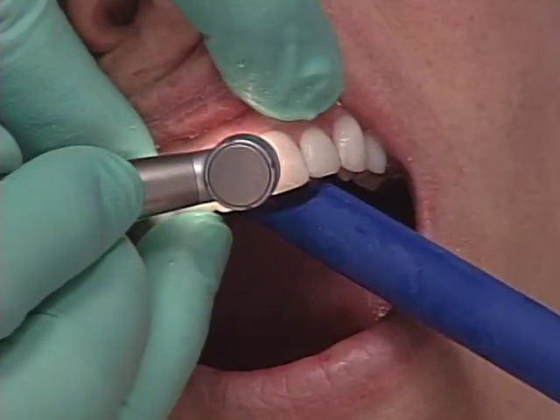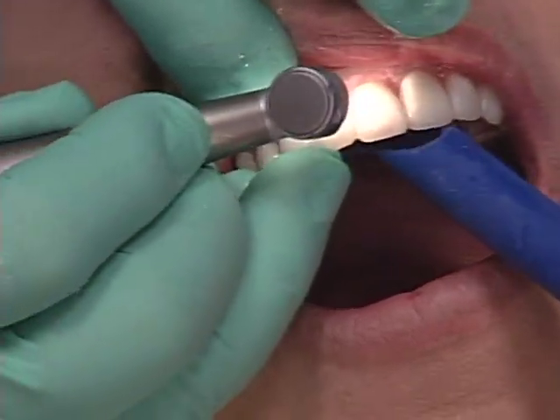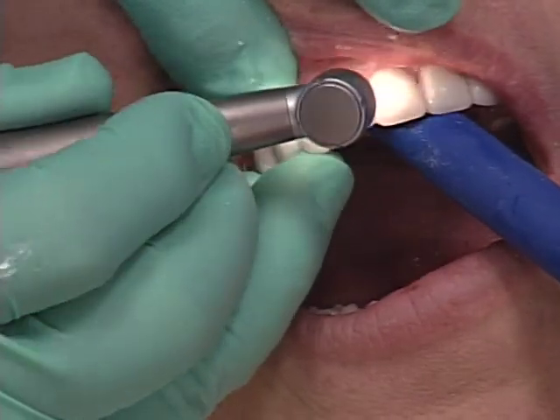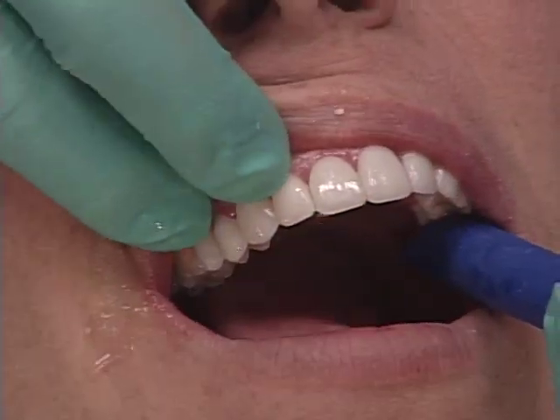One of the things you want to look out for is that black triangle. So I don't do too much finishing if patients have embrasures where they might have the black triangle. And you don't have to do it all today, do you? You're going to have the patient back next week.